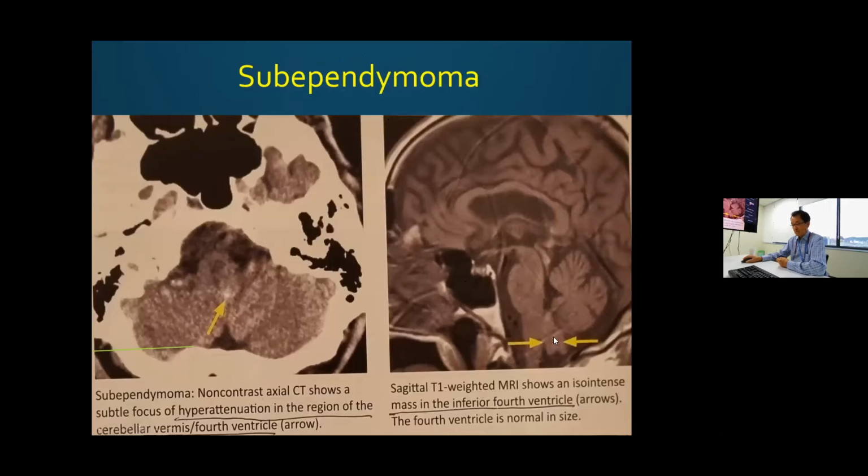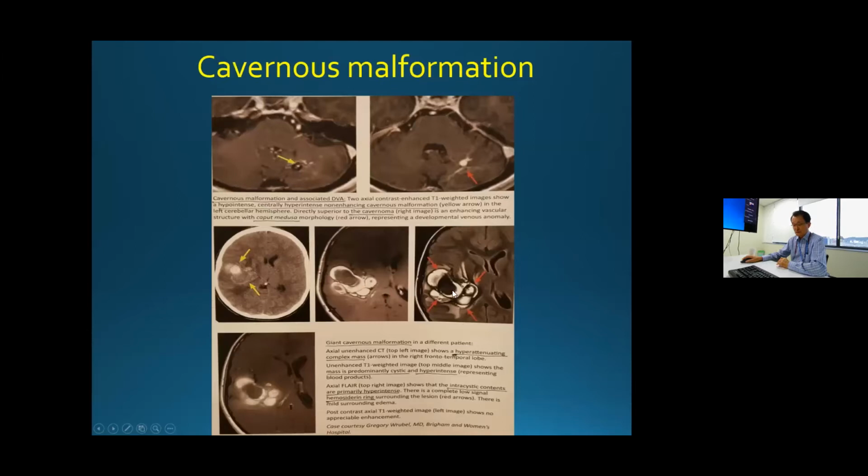This can block the cisterna magna and make obstruction. So the aqueduct of Sylvius is right here. When you see multiple irregular, well-defined lesions with some high and low signal intensity on MRI, you have to think about a vascular malformation; a cavernous malformation makes this kind of shape. On CT, sometimes there's a hematoma together with some soft tissue mass.